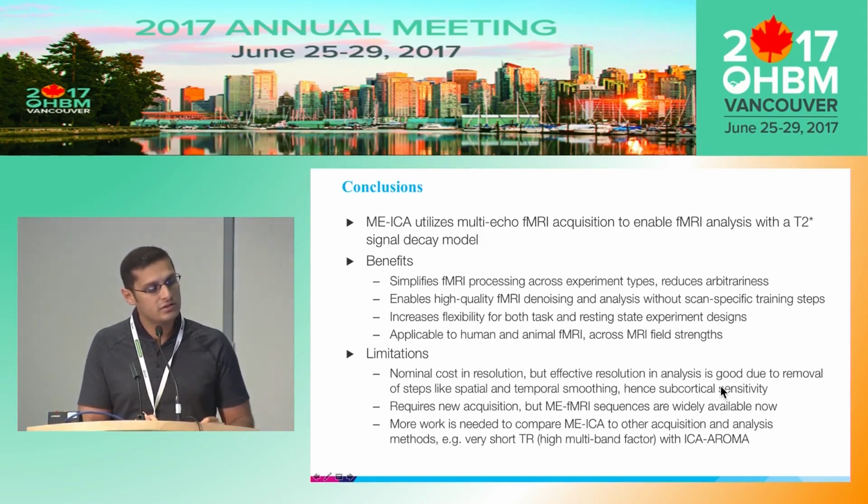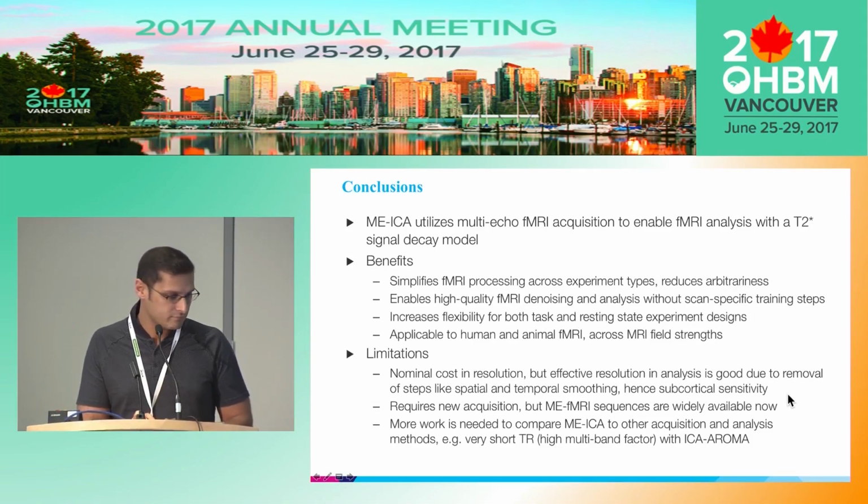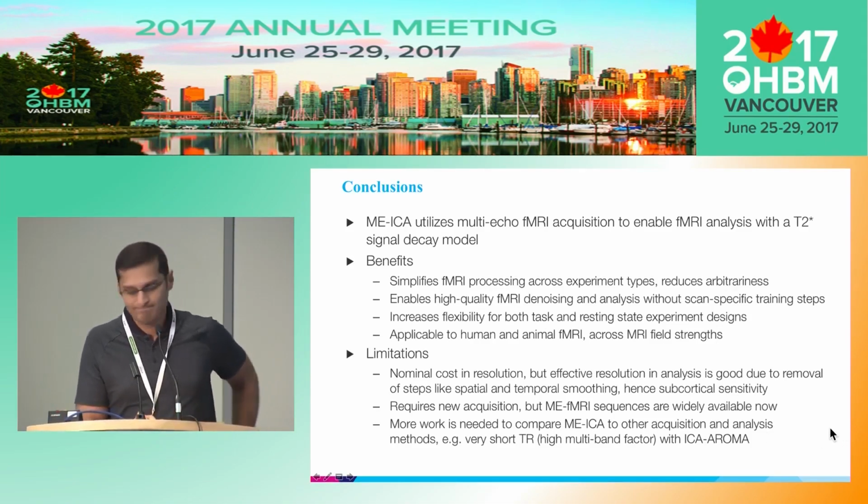Some limitations are there's some nominal cost in resolution, but our effective resolution is still good because we don't apply spatial smoothing, and we're also utilizing multiband. But more work is needed to compare MEICA to other acquisition types. Thanks.